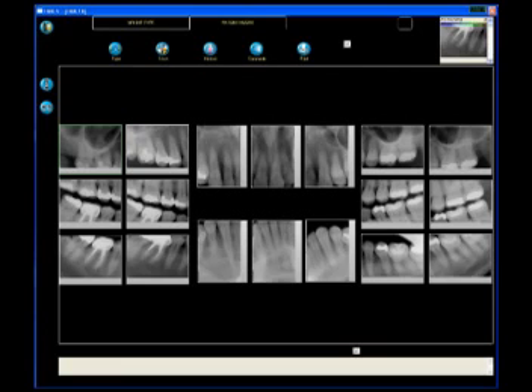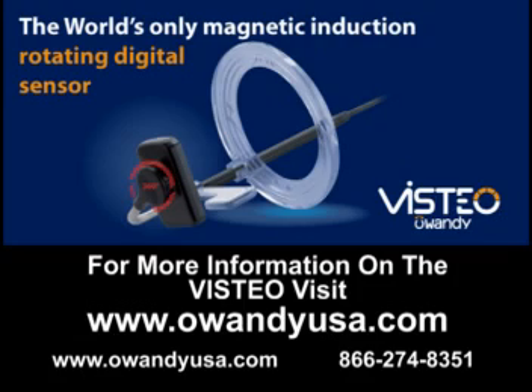Here is a complete FMX. For more information on Visteo, visit the Owandiusa website.